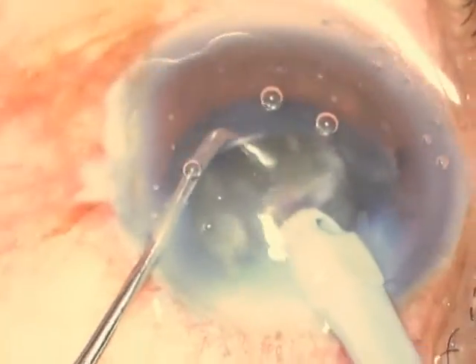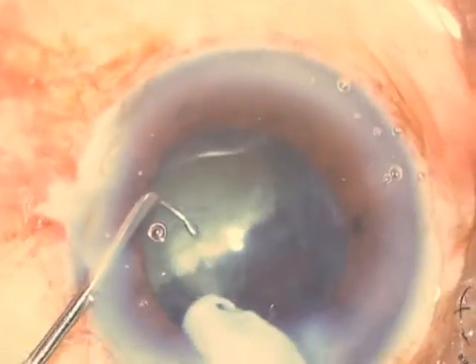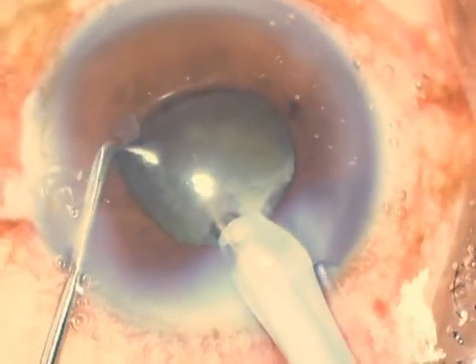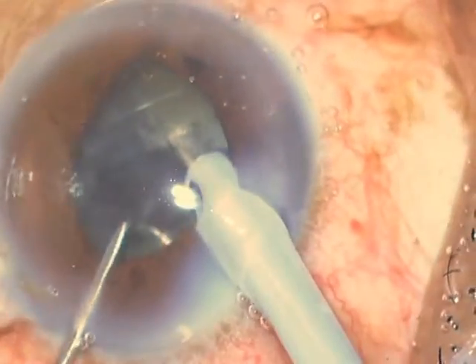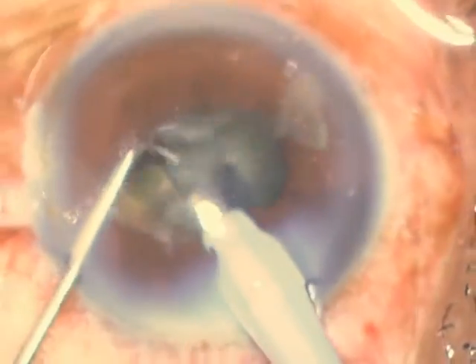I remove the second quarter, and now the superior half is free to be moved around. What I do now is impale the second half and bring it more to the center. At this point the iris is actually closing down, but since I'm able to move the nuclear fragment, it helps me to get it out in an easy fashion.